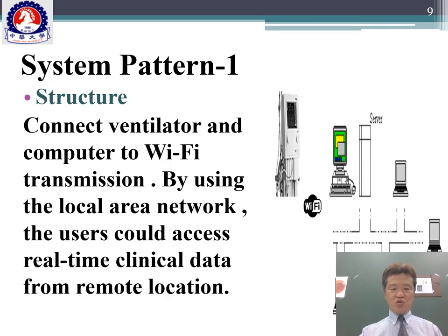System pattern 1, structure. Connect the ventilator and the computer to Wi-Fi. Transmission uses the local area network. The user can access real-time clinical data from a remote location.